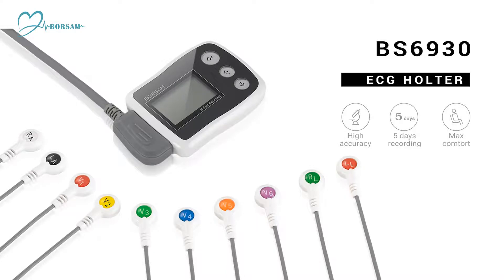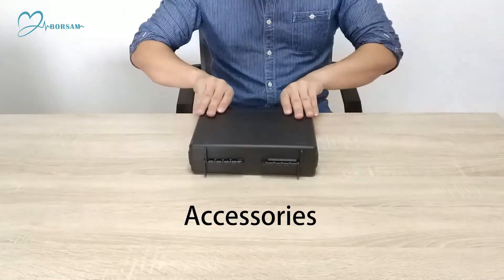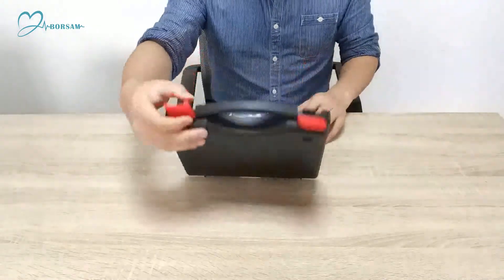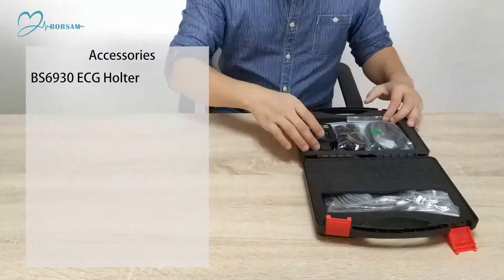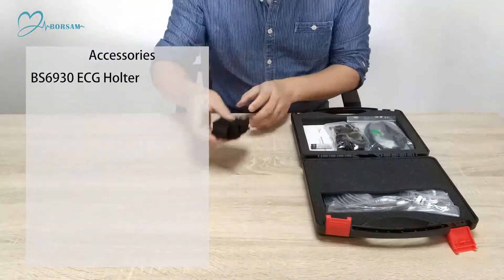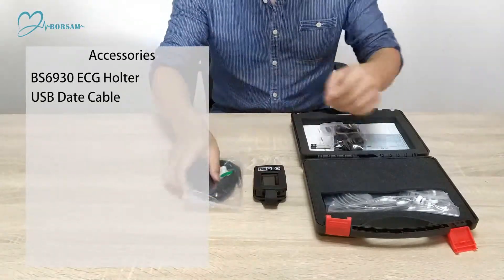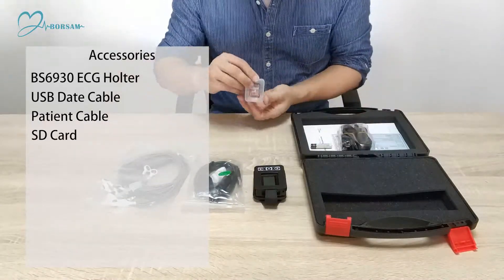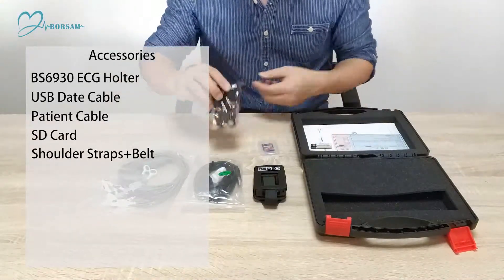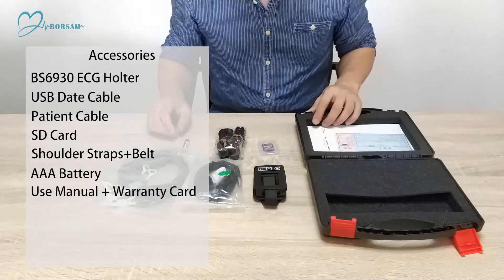BS6930 ECG Holter accessories include: USB data cable, patient cable, SD card, shoulder straps and belt, battery, user manual, and warranty card.